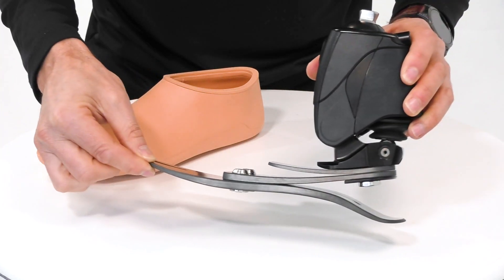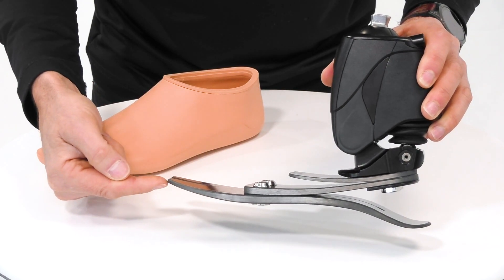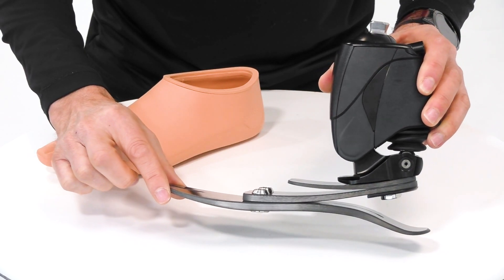Also during swing phase, we have a feature where we have dorsiflexion — the toe is rising during swing phase to further minimize the risk of trips and falls.